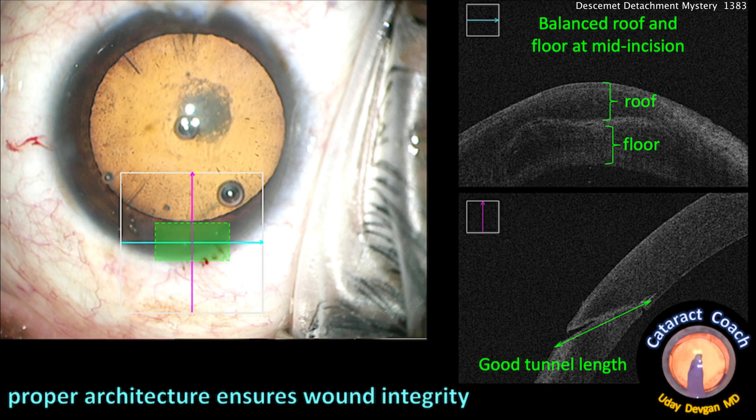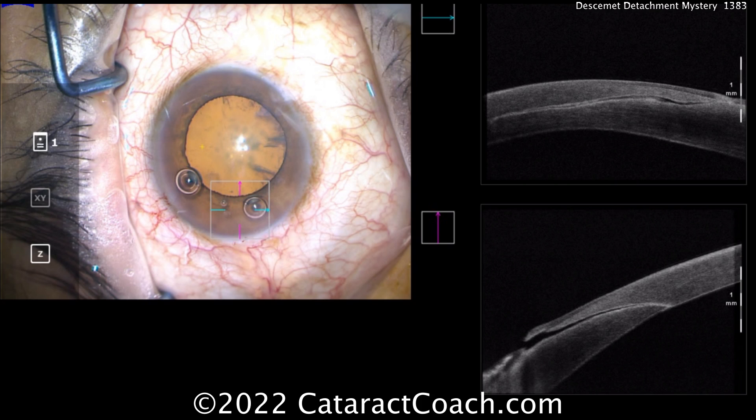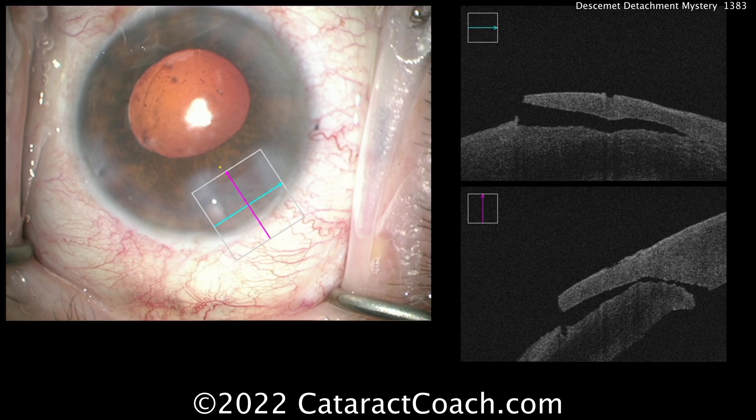As you enter the eye where Descemet's attaches, if you're not careful in placing your instruments you can detach it. Here's another example — this is a slightly longer incision with a bit more of a curve where it enters the eye. We need to be careful not to damage the Descemet's attachment point. Now what does a bad incision look like? Here's one — you can see a very thin flap with an abrupt change in angle entering the eye.